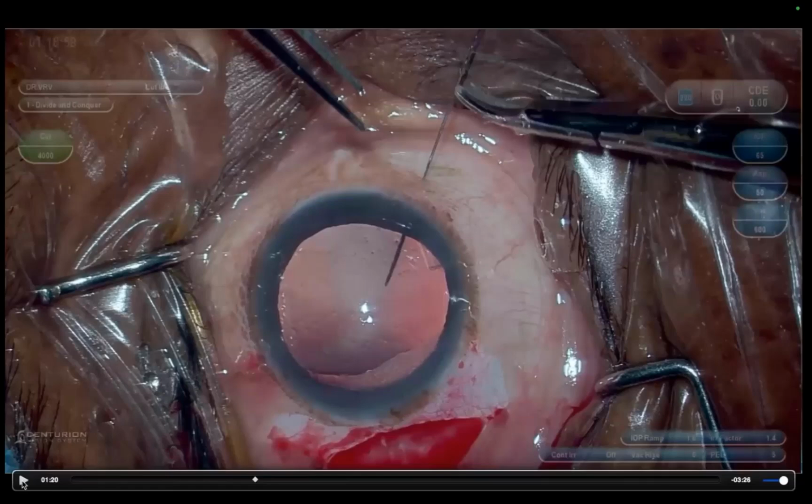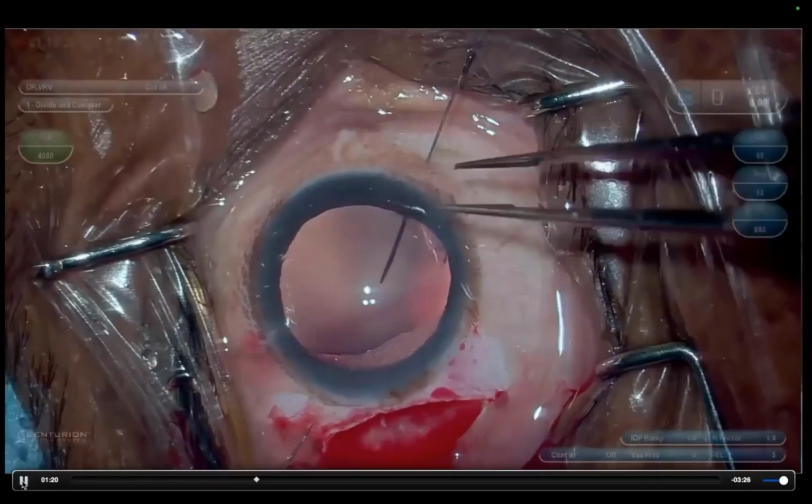If you are going to do a direct puncture, from the open sky to the vitreous, there's going to be a direct connection. So you position the needle, move the tenons and conjunctiva radially towards the limbus, and then do the sclerotomy. If you do that, at the end of surgery, you'll see that the scleral opening is at a different site and the conjunctival tenons opening is at a different site. So you can be less worried about having an infection.